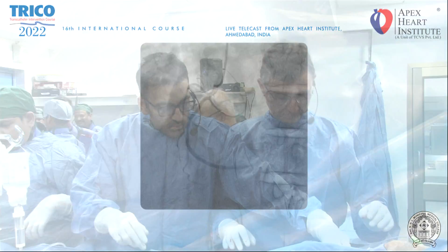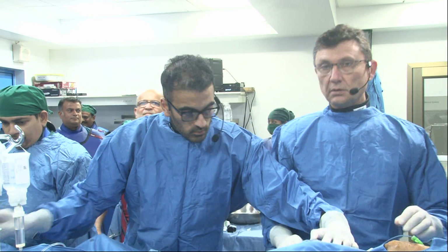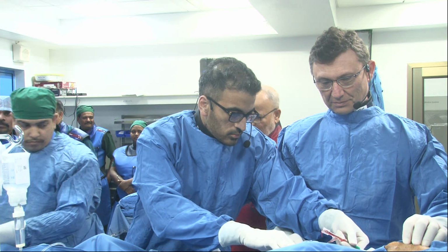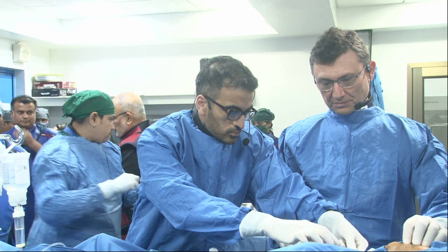Back to cath lab. Yes, we are now back live, sir. Yeah. So, Mauricio Cohen. Hey. Yeah. Mauricio, what is going to be your strategy?